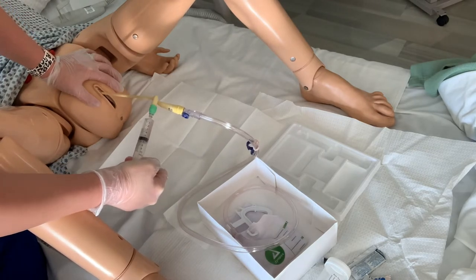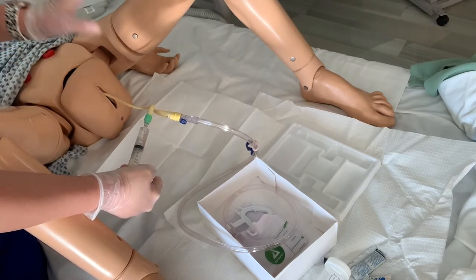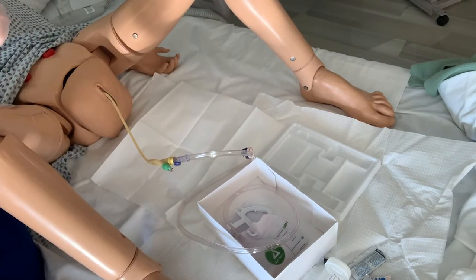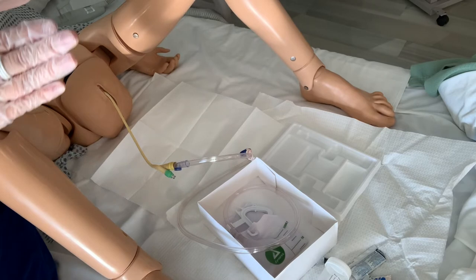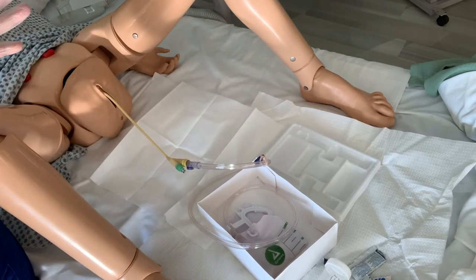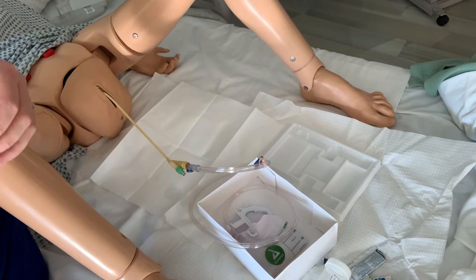I've got 5 cc's in there — this takes some practice. At this point, nothing needs to be sterile because we're done being sterile now. I can take this hand and gently take off the syringe. We're going to let that stay there and get rid of the syringe to the side. We need to check to make sure we can feel resistance — that the balloon is in the right place, that it's not coming out. We feel our balloon expanding. Then we can take off our gloves and discard them.